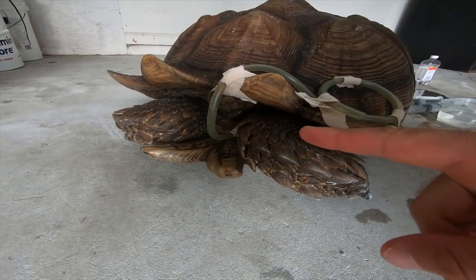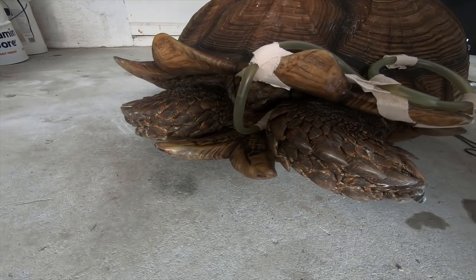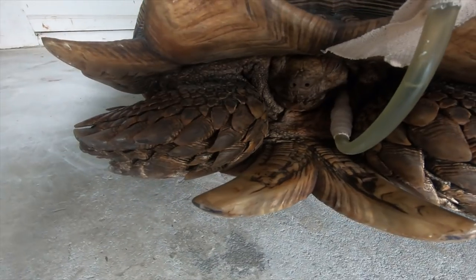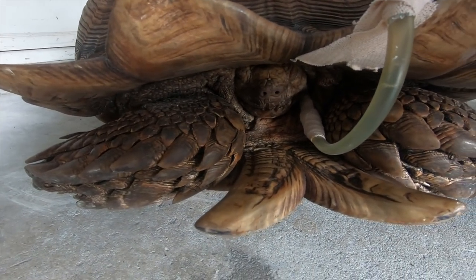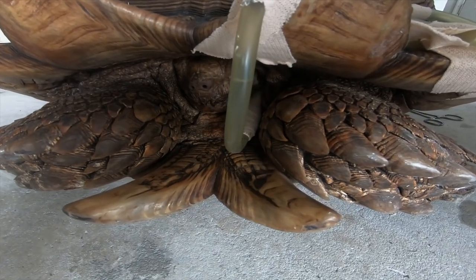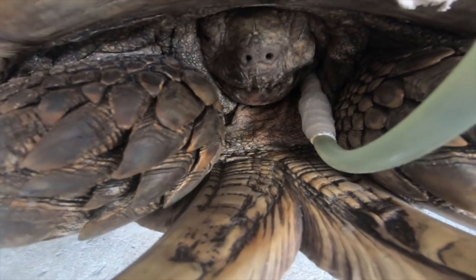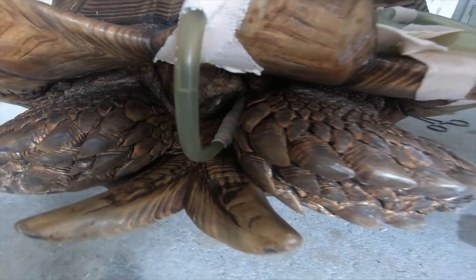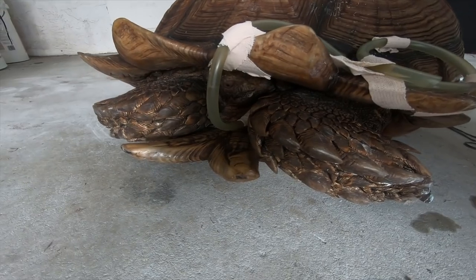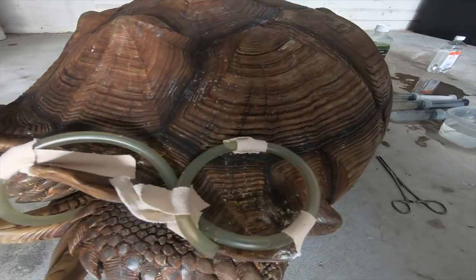Now, the first time he did it, we used a smaller diameter tube, and unfortunately some of the critical care, which I'll show you guys in a moment, it's kind of a liquid food that I mixed up, actually got impacted in the tube, and so we had to remove it and put a larger diameter tube down his throat. He can still move, he can walk, he's been walking around, which is good, his eyes are open, but there is an actual suture around this tube as it goes through his neck and into his stomach.